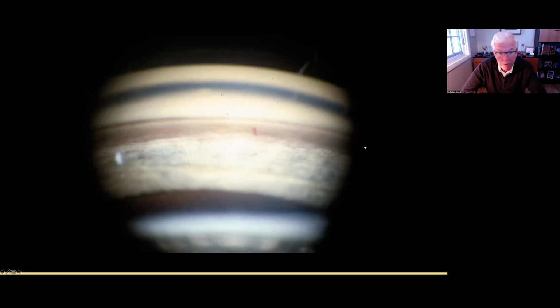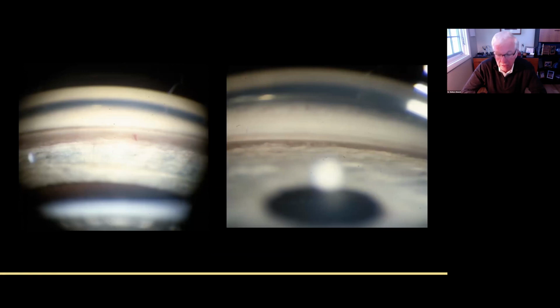This is a patient where we see pigmented trabecular meshwork here, scleral spur, really wide ciliary body face. So do they have angle recession? Or are they just a myope? And it helps to look at the other eye. When you look at the other eye, you can see that the ciliary body is lighter on this eye. And that's because we've torn into the ciliary body and there's less ciliary body between you and the sclera. So usually in angle recession, it's lighter in color like we see here. Weirdly, sometimes it's darker. Don't ask me to explain that. I don't understand that. And you see iris processes in this uninvolved eye, and there's none left in the involved eye.